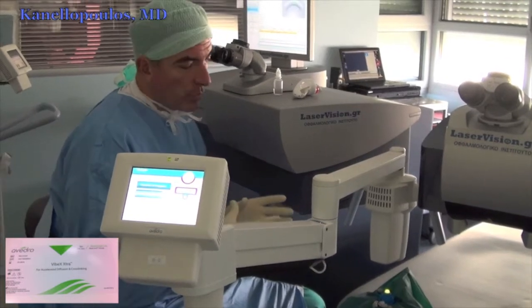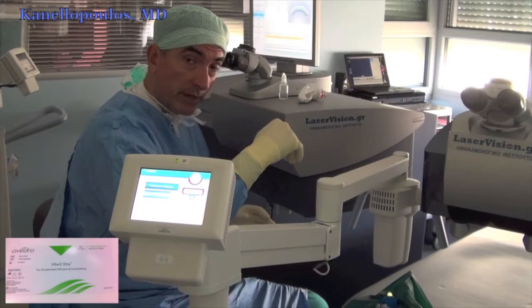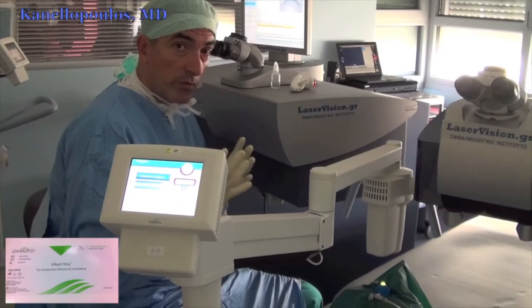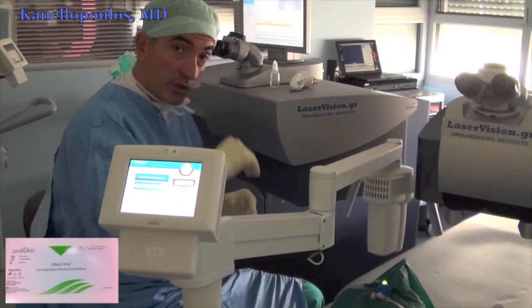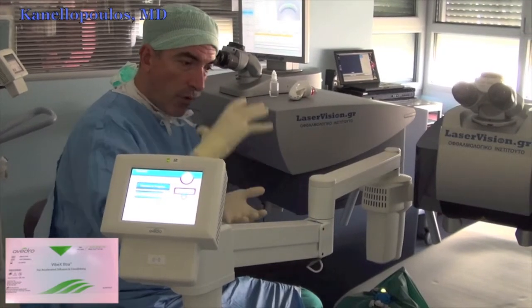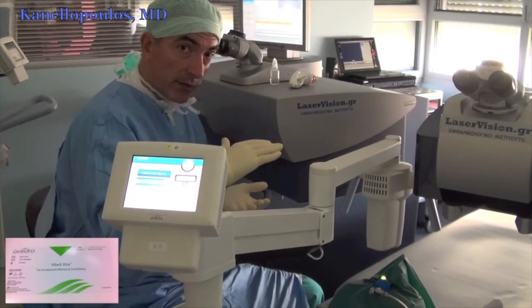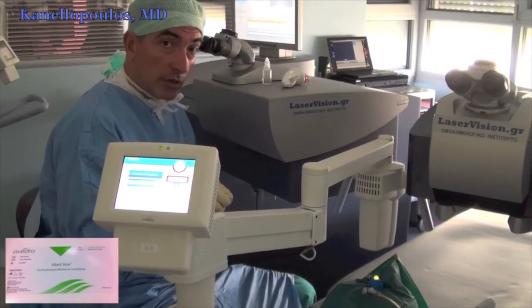In essence, what we're trying to do here is have UV light go through the translucent cornea that is not soaked with riboflavin, reach the pocket — which now has diffused riboflavin over and under it. Remember, the pocket is at 400 microns. And try to achieve the cross-link.